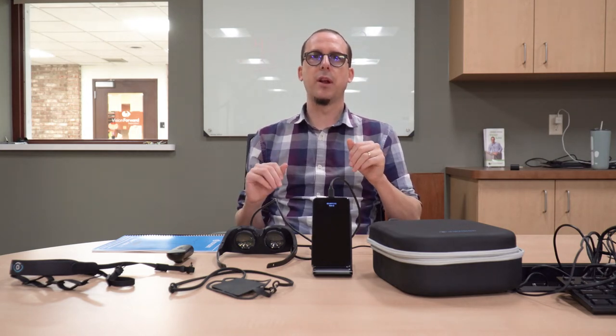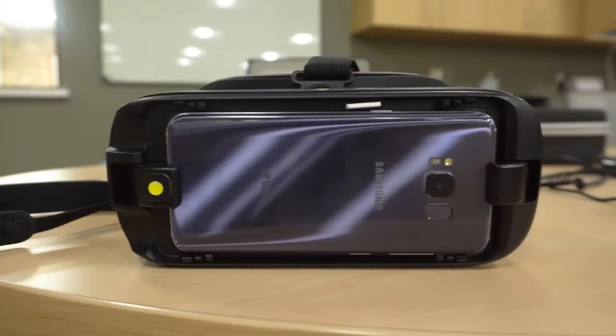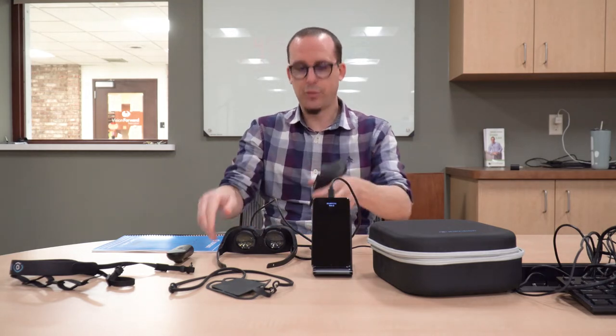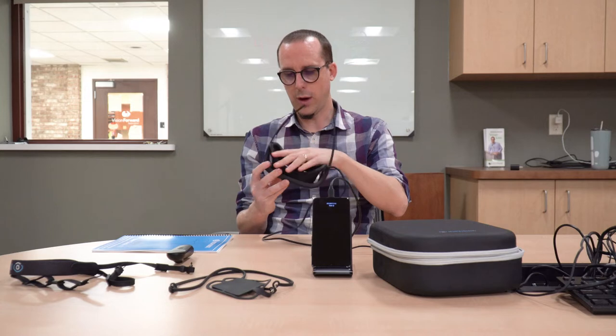Being mobile is something which you cannot do with the IrisVision Live device. If you're not familiar with IrisVision Live, this is IrisVision's older headset - there should be a notification in the top right if you want to click to see our video on it. We will also be comparing the two devices at the end of this video. With the IrisVision Inspire, we can potentially walk while wearing it, which is really quite neat.